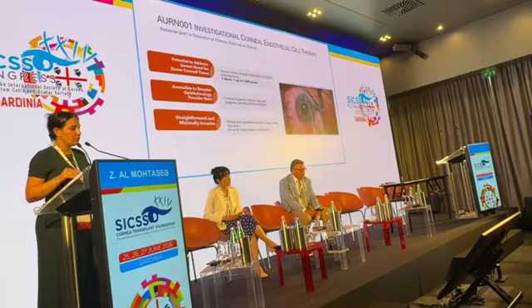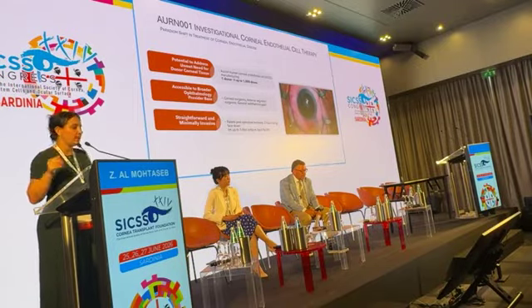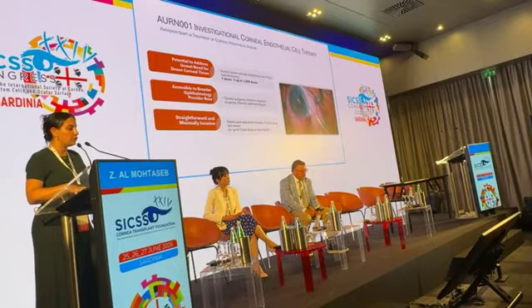So what you do in this procedure is you go in with a 1.2 millimeter incision with a silicone tip irrigator to polish the endothelium. So you're not removing endothelial cells, but you are polishing it and mechanically blunting the guttae that are there. The reason we put in the Trypan blue, which you won't need to do in the procedure itself, is just to make sure that you polish correctly in the zone between 6 to 8 millimeters. And then you inject the endothelial cells into the anterior chamber. And then you're done with that procedure.